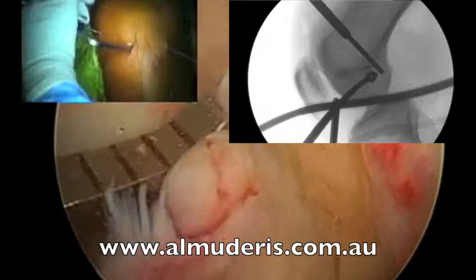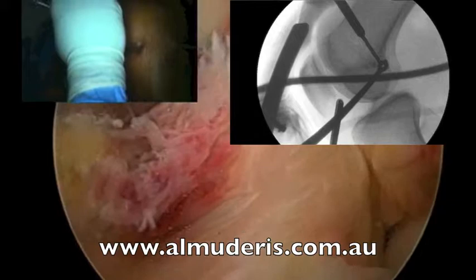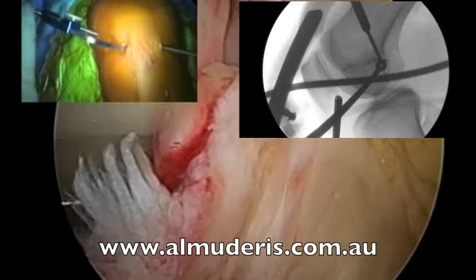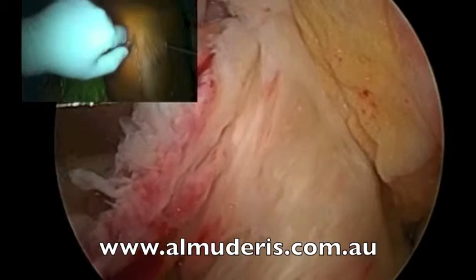Then we unflip the cutter and insert the guide again. We have finished drilling the flip cutter on the femur side, and then we pass the wire through the femur. X-ray. Using a special wire. X-ray — save this one. And then we take the jig out.